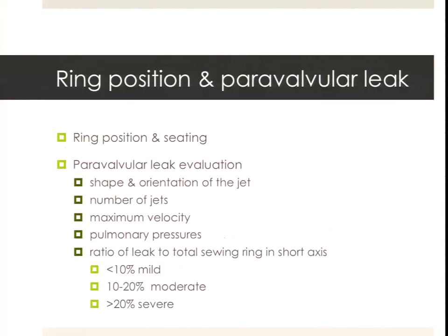So now, bear in mind, early recurrence of paravalvular leak is associated with technical aspects of the surgical implant, you know, the tension or abnormal pressure and traction forces on the prosthesis. Down the line, it's a different kettle of fish. You know, it's suture dehiscence from endocarditis or resorption, incompletely debrided areas, those sorts of things.